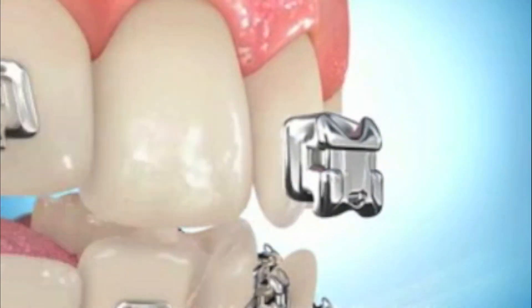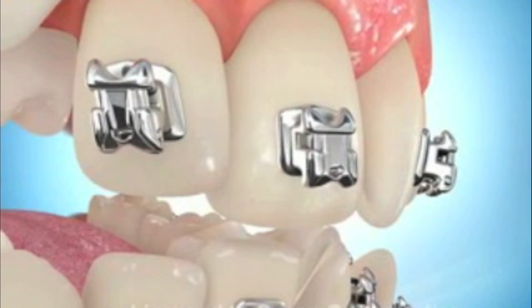Hi everybody. I can't tell you how many times I've been asked how do braces work. It's a bit like asking a mechanic how does a car work — there's actually a little bit more to it than you might think. In the beginning, the critical thing is that the orthodontist places the brackets in the right spots so that when the braces work, the teeth line up. If the brackets don't go on right, the teeth don't line up right.